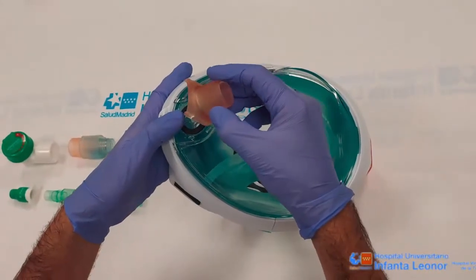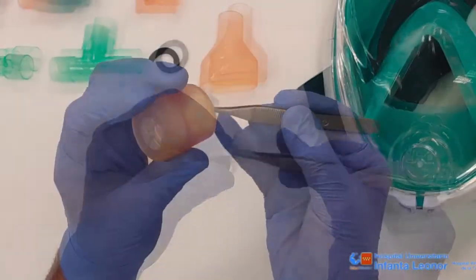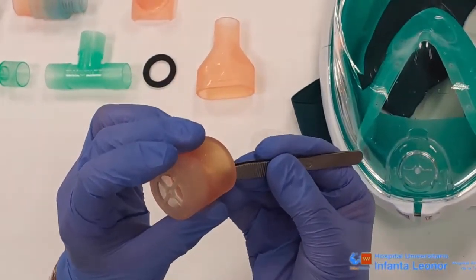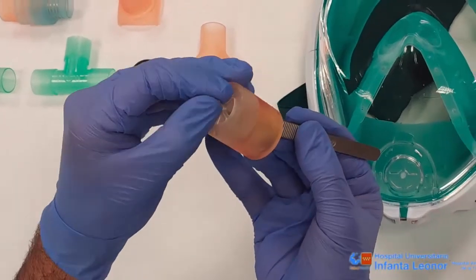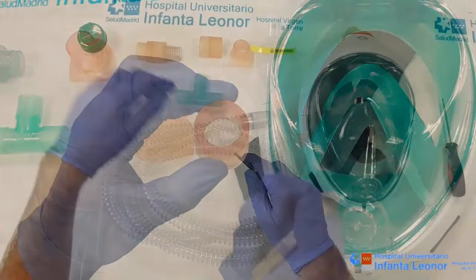Next, we place the front piece using an O-ring to decrease permeability in the system. We place one of the internal membranes inside the anti-asphyxiation valve, doing so from the inside to permit entrance of air but not exit.